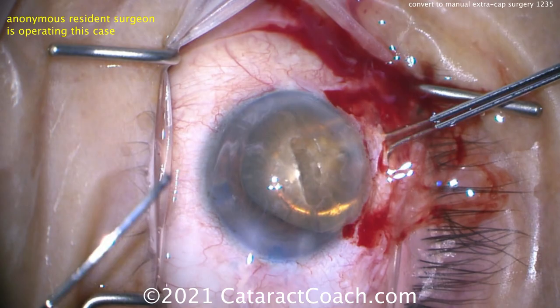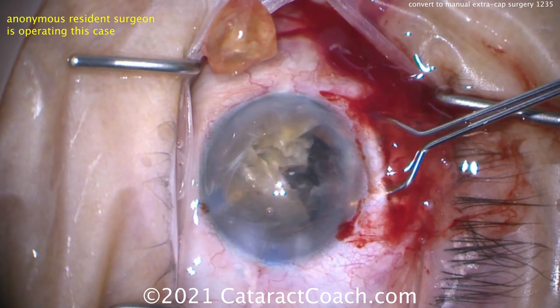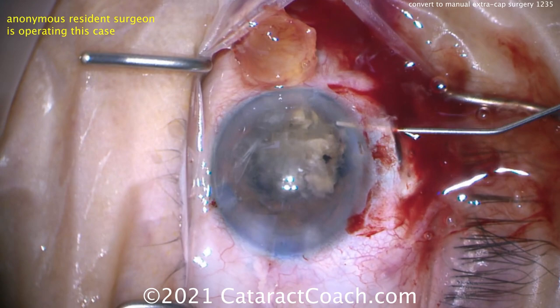Here comes a lens loop going under the nucleus to push it out of the eye. The nucleus was already grooved so it's going to split apart — that's okay. Use plenty of viscoelastic, protect the cornea, protect the remaining capsule and iris tissue, and let's get that lens out. Pushing it out. The lens nucleus is removed from the eye.